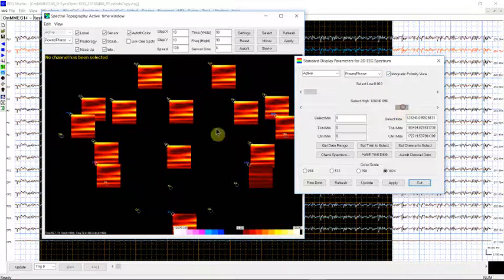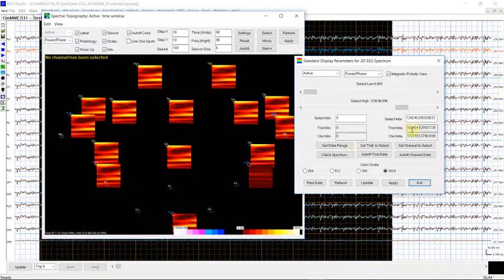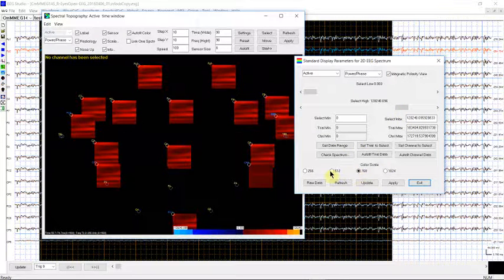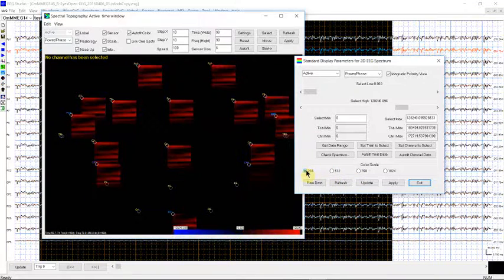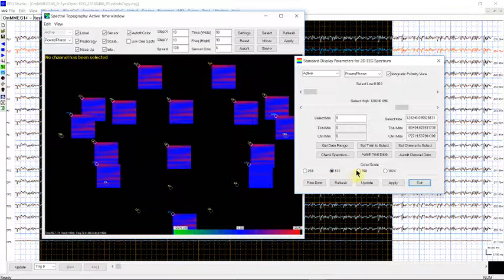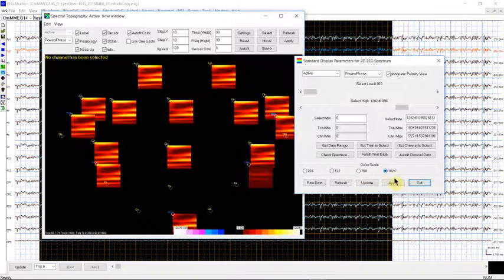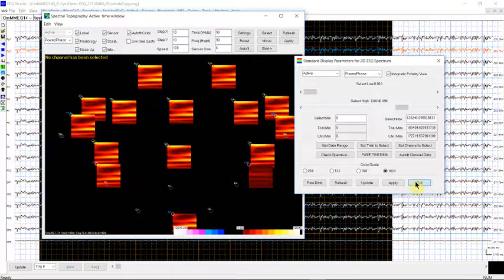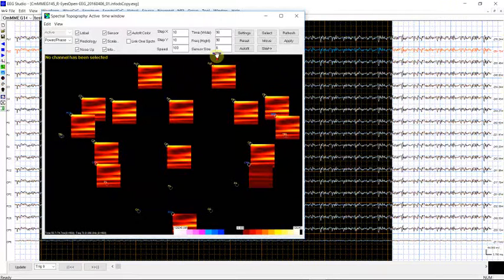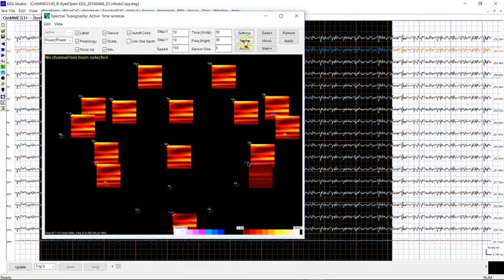You can see the spectral power here, and we can also change the color style. And we can reset.